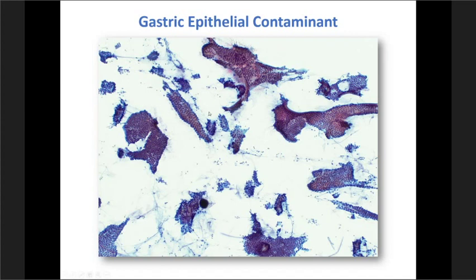But what is helpful is take a look at the background. There is mucin here, but the mucin is more watery, more luminal. But the cells themselves are representing, again, honeycomb cells. They do have a mucinous arrangement, as you can see here and here. They are flat sheets, honeycomb. There is no evidence of a goblet cell population that I can identify here.